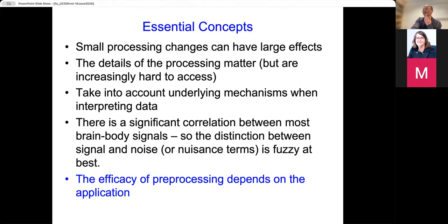This is something that I struggle with in my lab, because sometimes, especially if it's a novel data set, we don't know what's going on, there's breathing and all that stuff. Does it make sense to look at data with and without global regression? Yeah, I think so. It's not like cheating or anything, right? You're trying to see what's cleaner.